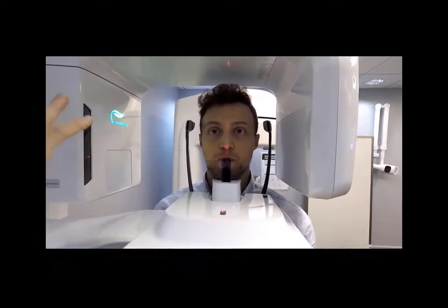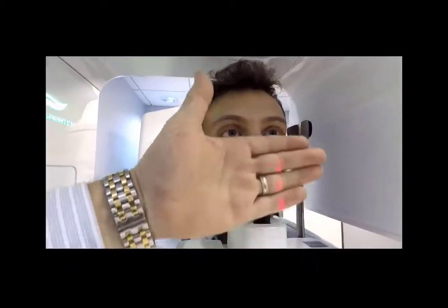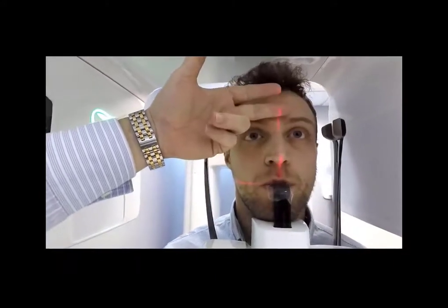Great. So here are lights I want to make sure that we identify that are different than 2D. However, here's one light that is going to be the same for every single image we capture, which is this mid-sagittal light. See how it's going through the middle of the patient's face, in between the eyebrows and the philtrum there.